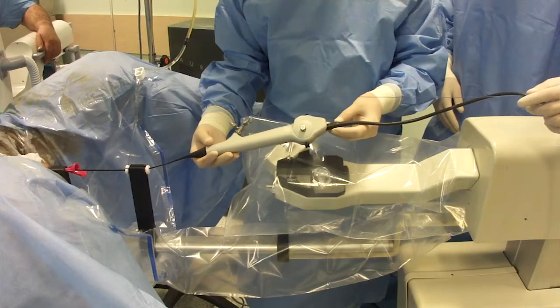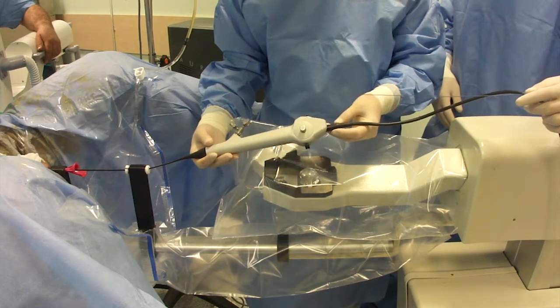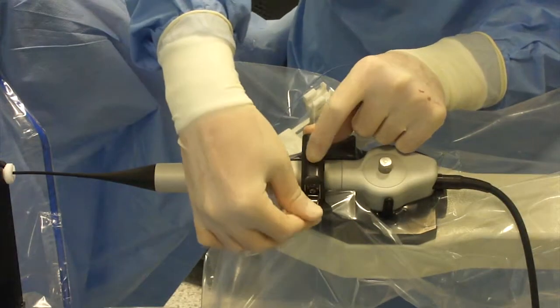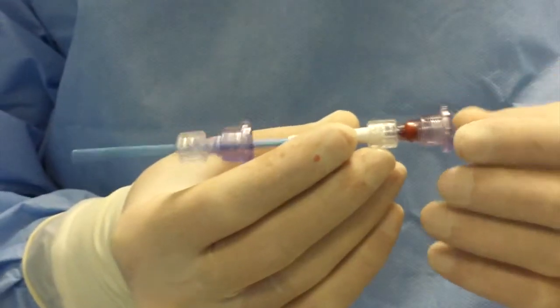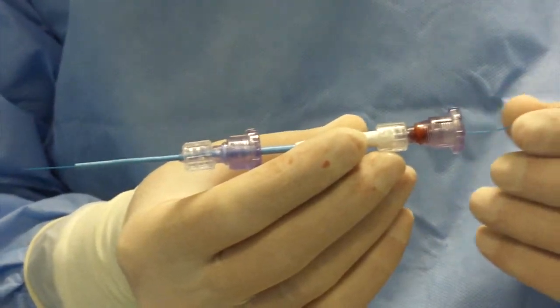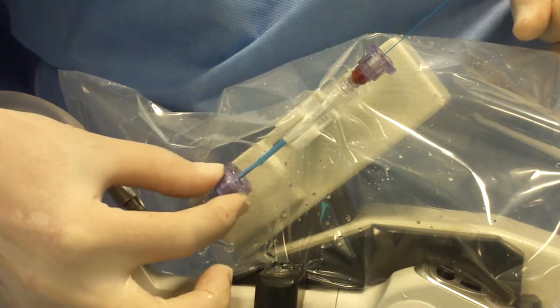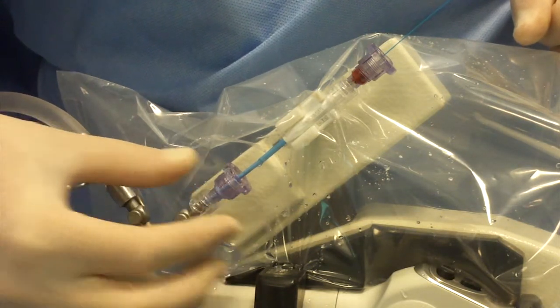Then the handpiece of the scope is locked into the robotic arm. Finally, the laser fiber actuator is attached and the laser fiber inserted into the channel. The entire docking maneuver takes less than 60 seconds.